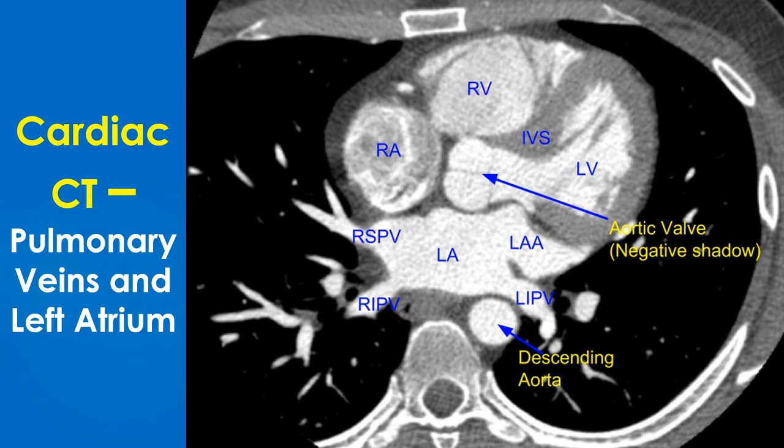Aortic leaflets are seen as negative shadows within the contrast-filled aorta. Since this is not a true cross-sectional image of the aorta, the aortic valve leaflets take an inverted T pattern; in a true cross-section they would appear as a tri-radiate pattern. The interventricular septum is also visible as a negative shadow between the contrast-filled right and left ventricular cavities.